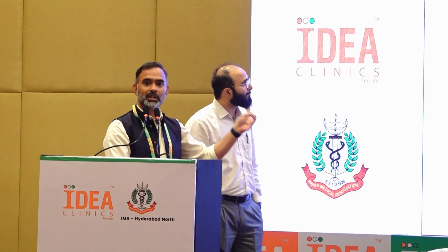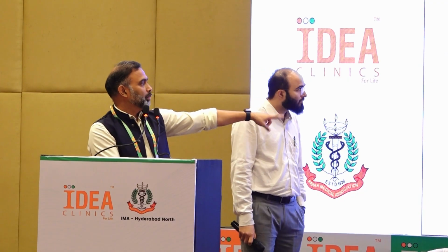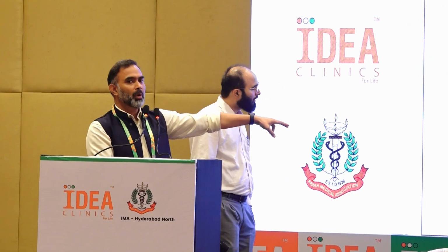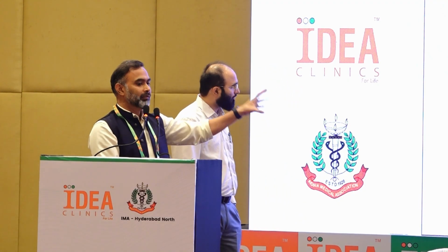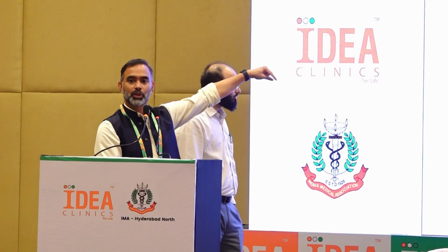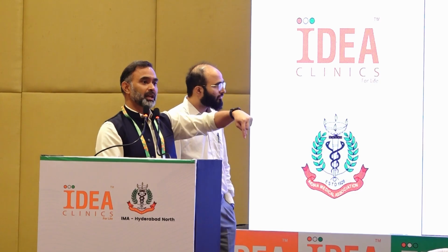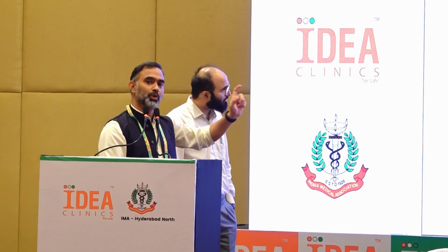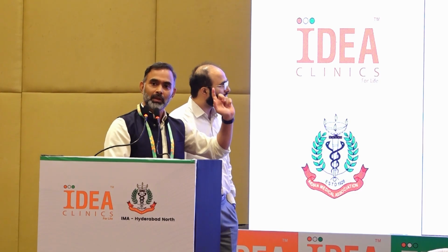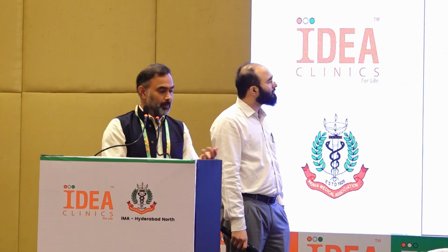Third feature is about suspend before low, not suspend on low. The pink graphs at the bottom are where the insulin is being delivered. If you see the gaps there, the pump has expected that the sugar is going down, and once it is anticipating that it will reach a hypo, it will automatically stop the insulin delivery. What happens after that? Our body has counter-regulatory responses. It will bring it out of the hypoglycemia.